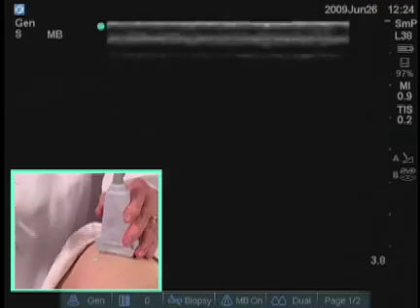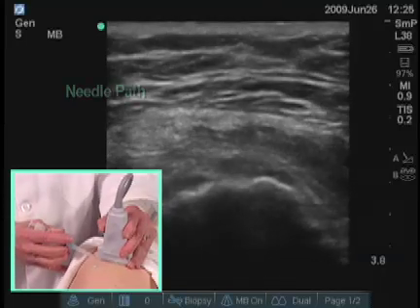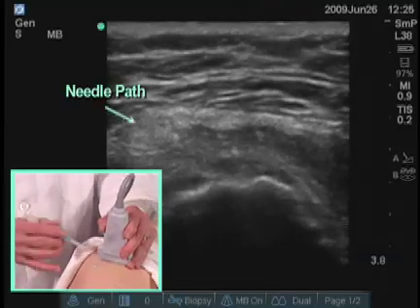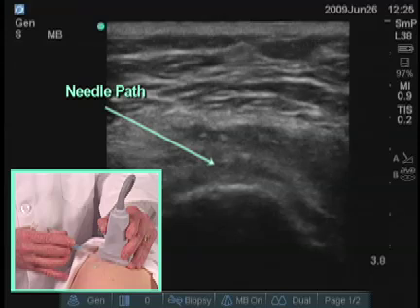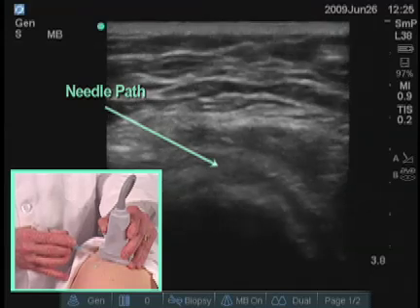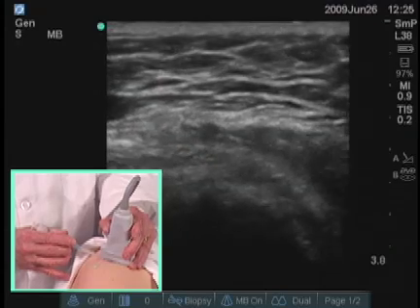This can also be injected in a transverse plane. Sometimes it's easier to have the alignment going in the same direction as you're looking. I'm looking across the patient at the ultrasound screen, and I now have my transducer pointing in that direction.